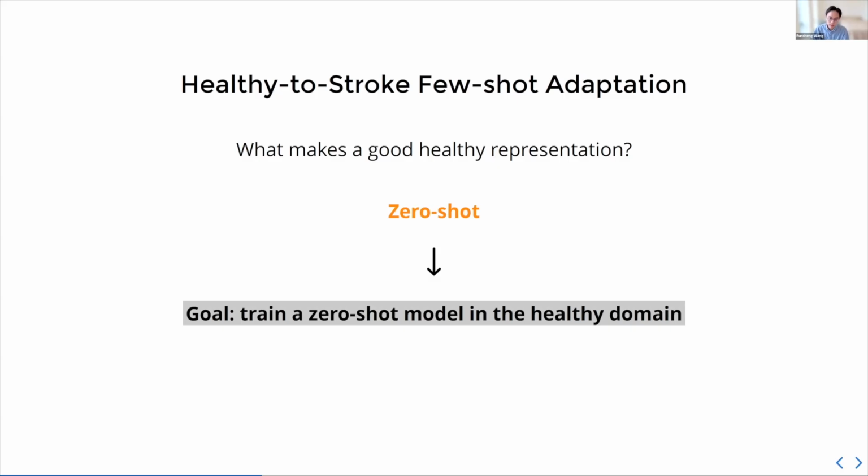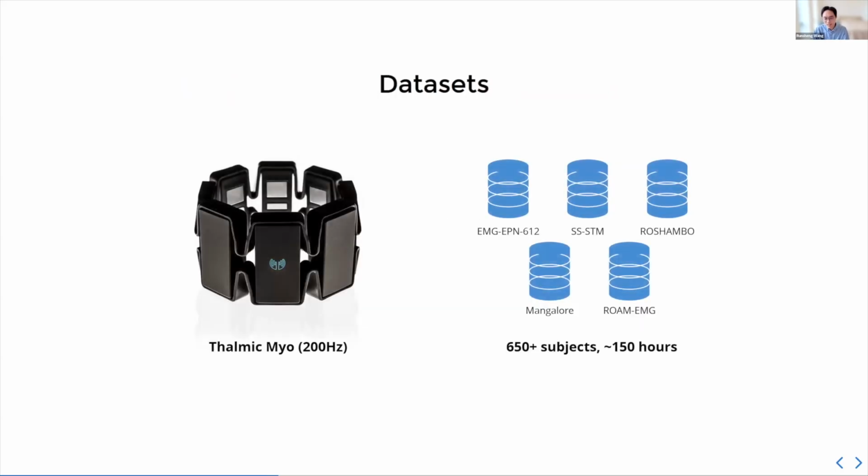And where do we start with that? The best place to start is to get as large of a data set as possible and as diverse as possible. So we're using the Thalmic Myo as the EMG sensor, which is an 8-channel, 200 Hz sensor meant to be placed on the forearm, as you saw earlier in the video. It is one of the oldest sensors. It was released in 2016. It's been 10 years now. It's still kind of the best sensor out there for general purpose EMG.